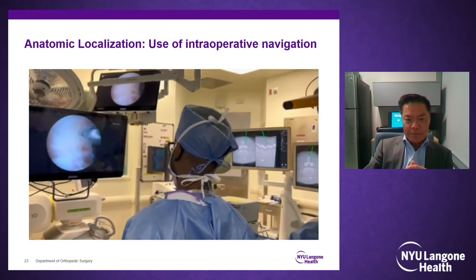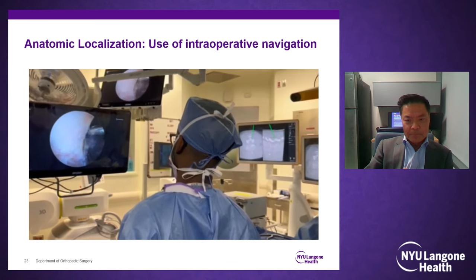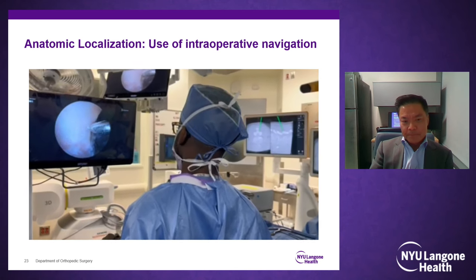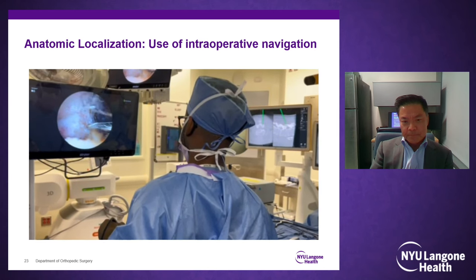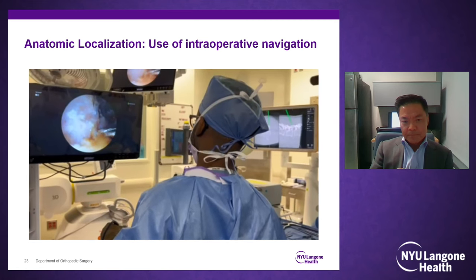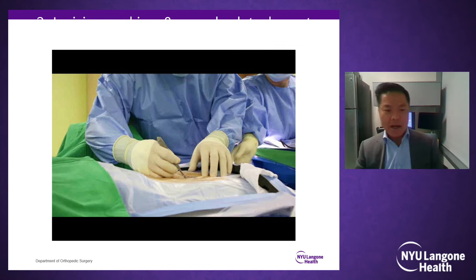Point to the fellow. Where you think is the spinal lamina line. And then show me the medial aspect of the capsule. Medial aspect of the capsule. And the inferior aspect of the facet. Inferior aspect of the facet. Excellent. So you get instant feedback, and I think that really accelerates their learning. And this can also be utilized to teach our colleagues as well.